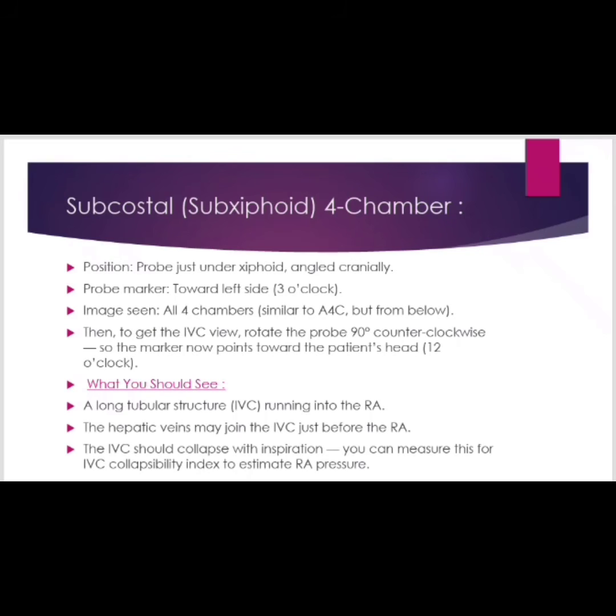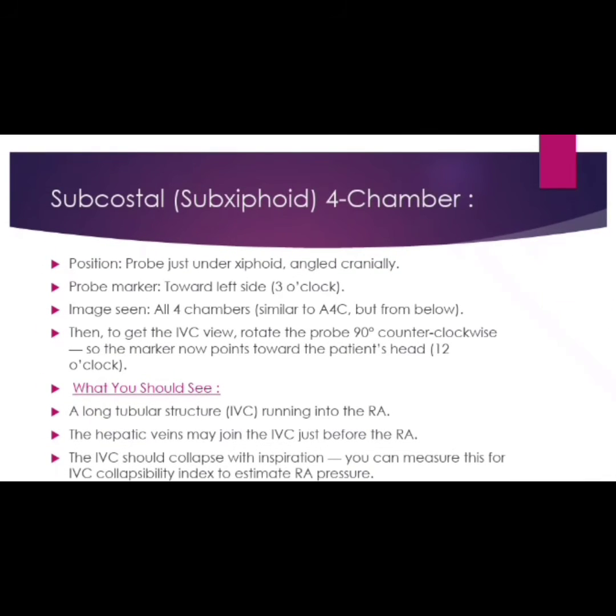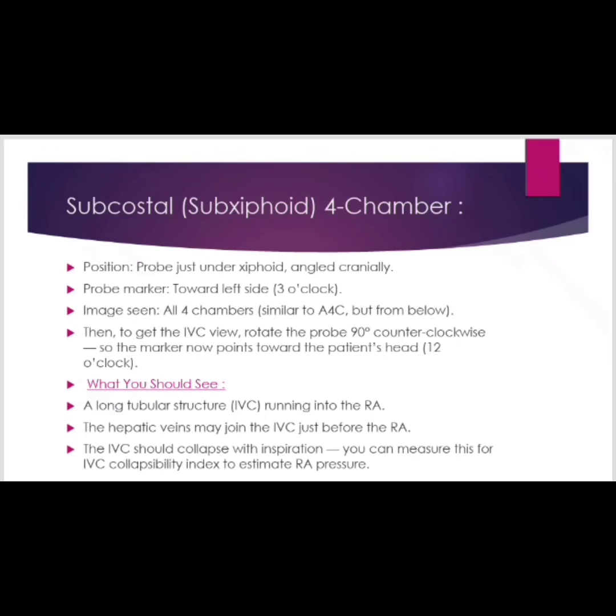Then to get the IVC view, rotate the probe 90 degrees counterclockwise. So the marker now points towards the patient's head, which is around 12 o'clock position. What you should see in this is a long tubular structure, the IVC, running into the RA.